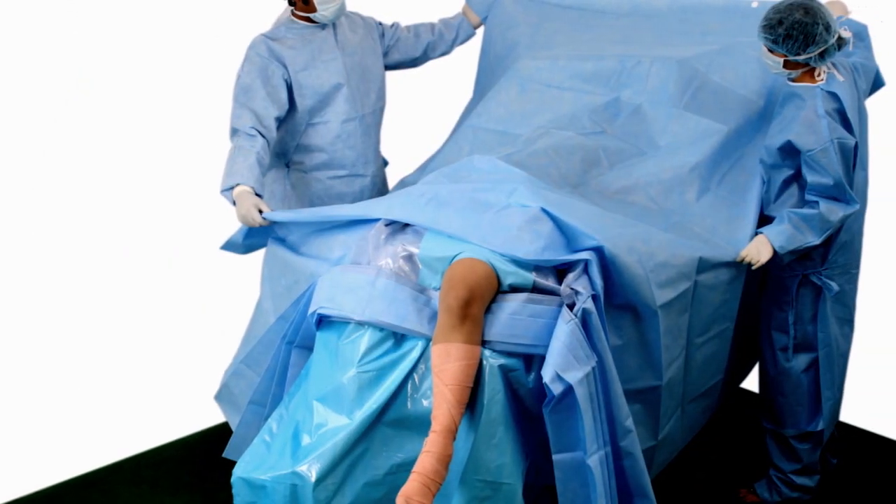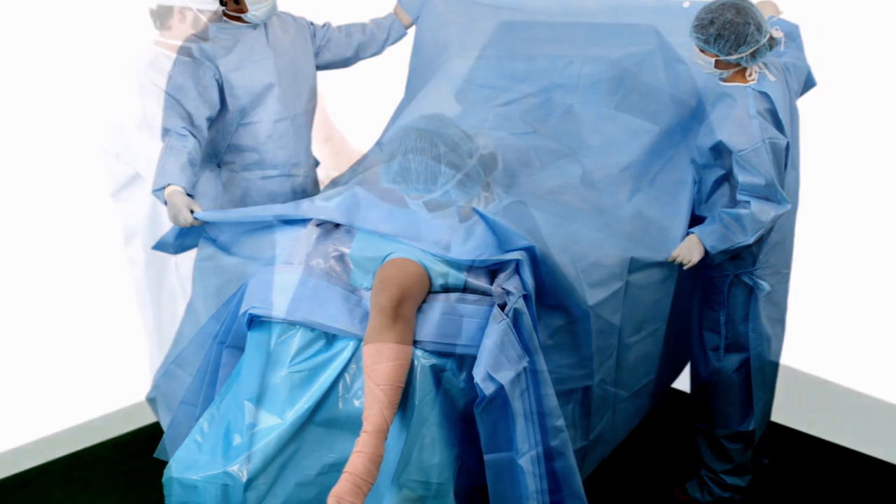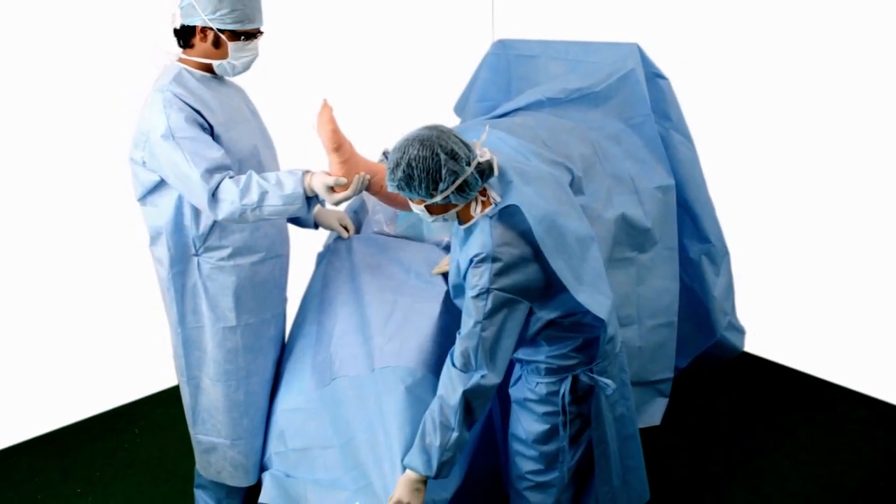Unfold drape laterally then toward head to form an anesthesia screen. Unfold the drape towards feet.